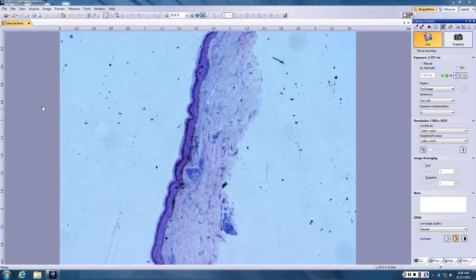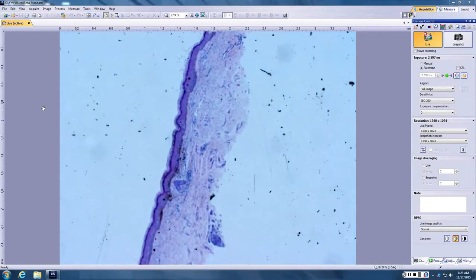Okay, Cheng. Lymphocytic proliferation around the DE junction, and I have some superficial scar. So melanocytic at the DE junction, and it's sitting on top of what appears to be a scar. Maybe regression, lichenoid regression of melanoma.